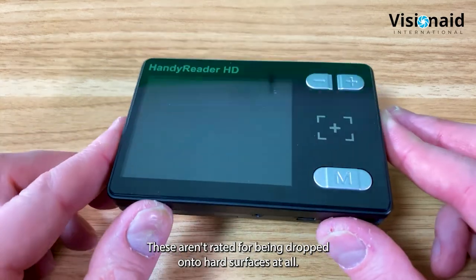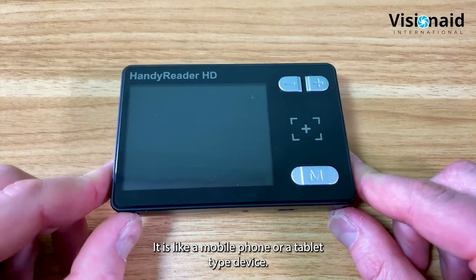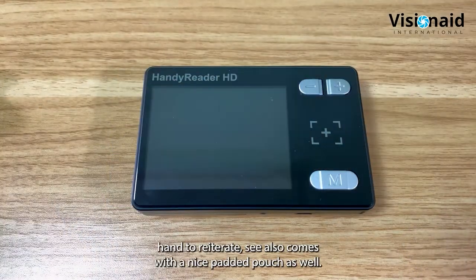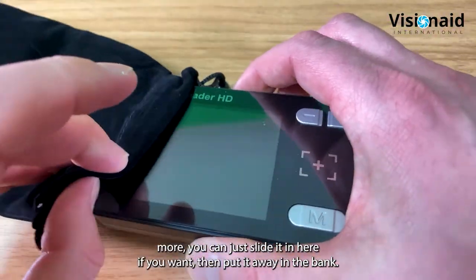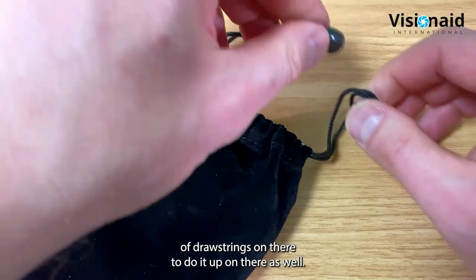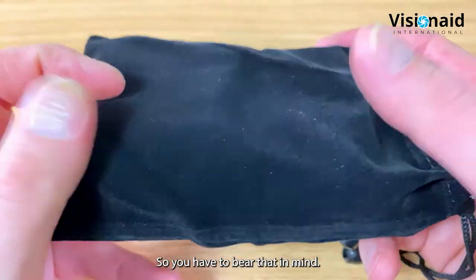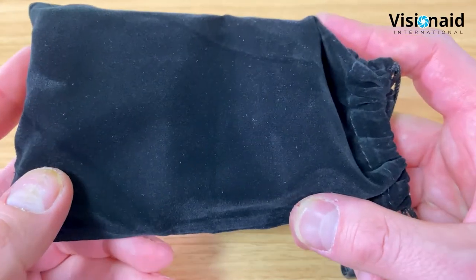These units aren't rated for drops onto hard surfaces - treat them like a mobile phone or tablet. The padded carry pouch gives more protection; slide the unit in and use the drawstrings to close it up. The soft felt lining protects the screen from scratches and minor bumps and knocks, though it won't stop crushing, so bear that in mind.